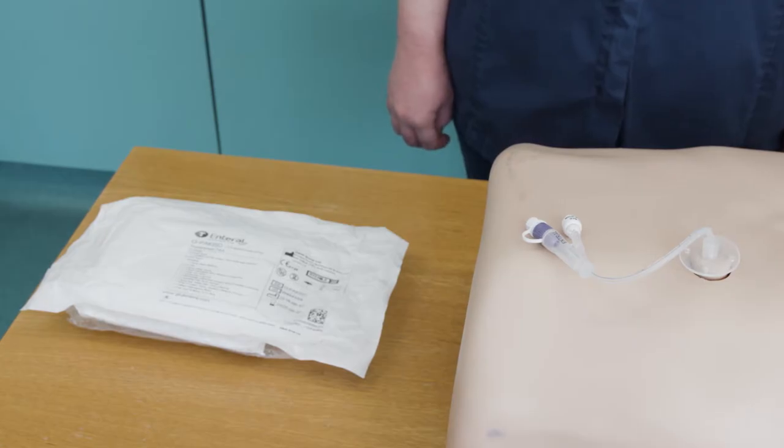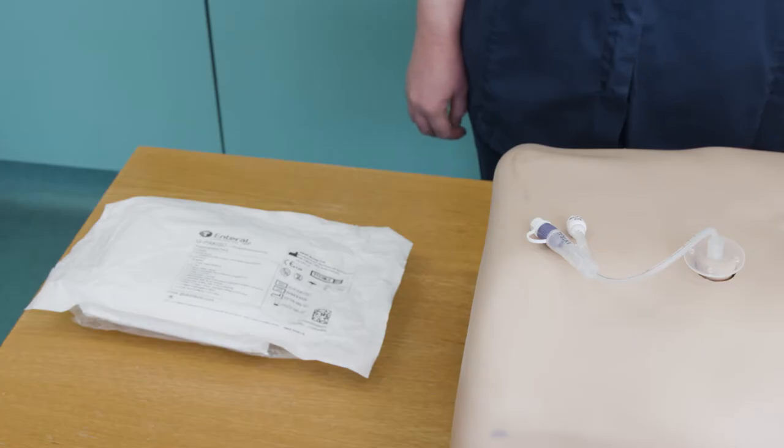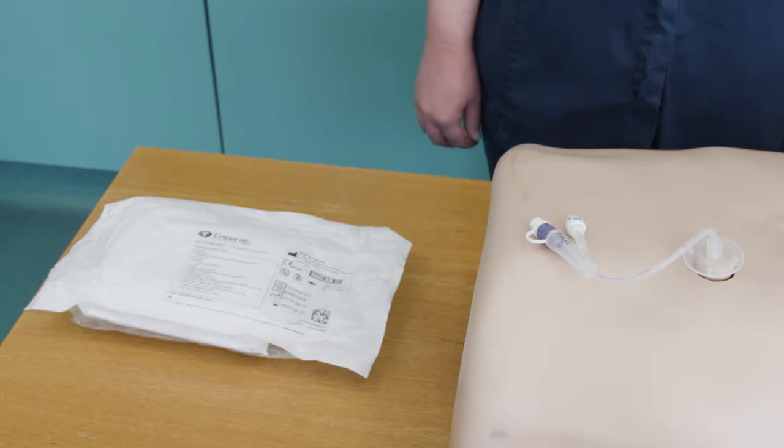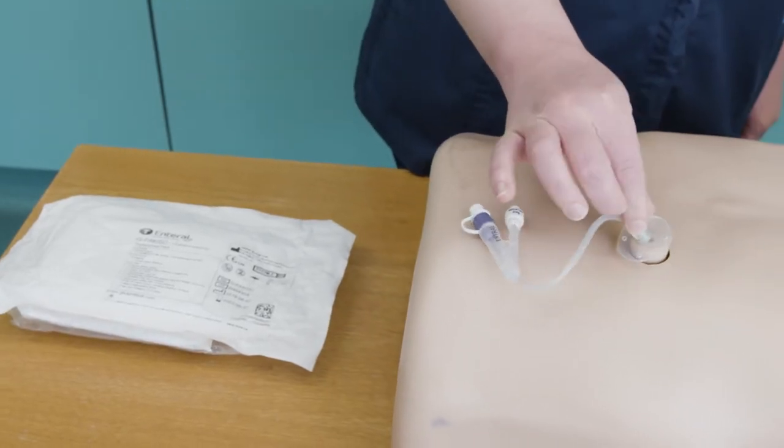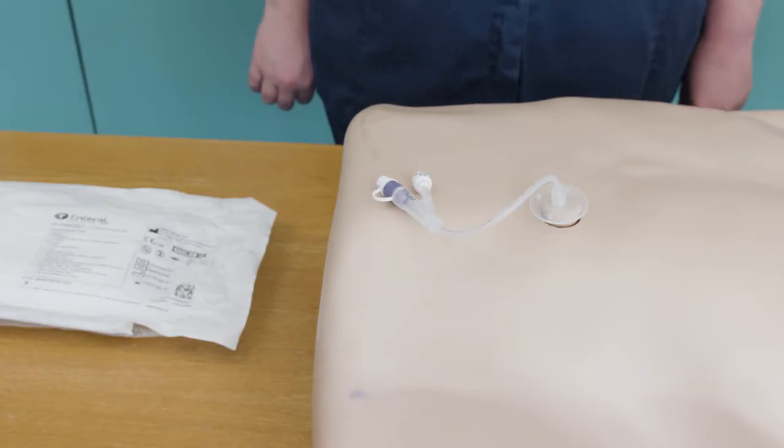Ensure the patient is lying or in a semi-upright position and is comfortable. Confirm the signal with the patient in case they want the procedure to stop. Review the stoma site, as if infection is suspected then the procedure may need to be postponed until the infection has been treated and has resolved.